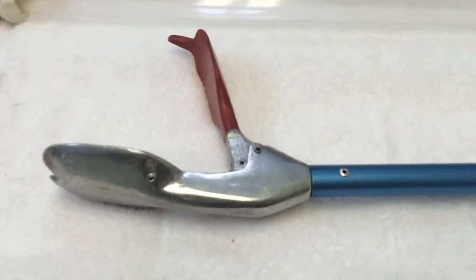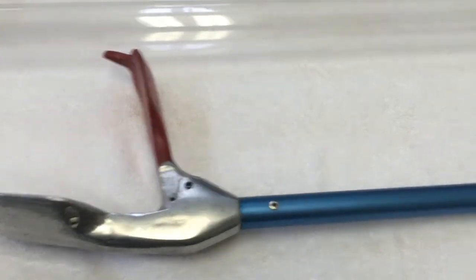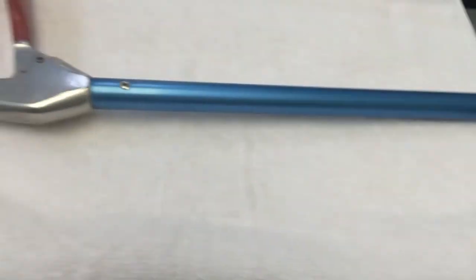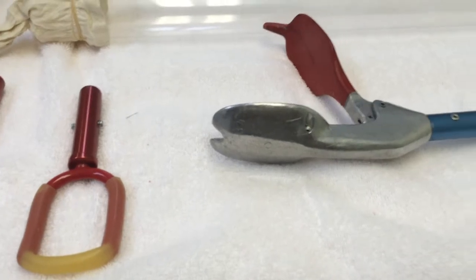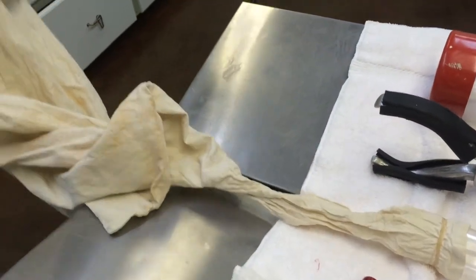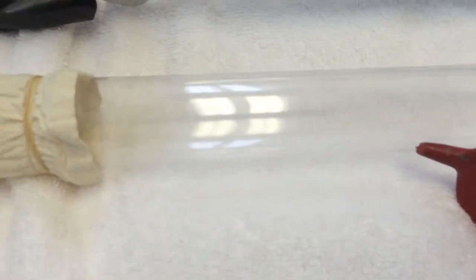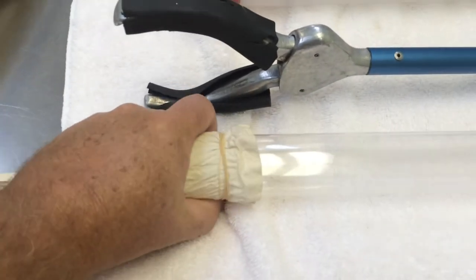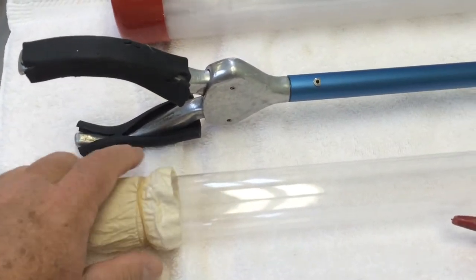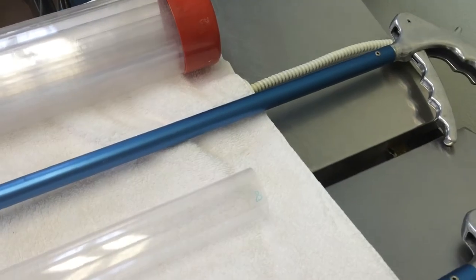Then we have here our gentle giants, the short version, because sometimes the long stuff just gets to be a pain in the butt. It turns out that my little bag here, you can actually put the snake in there. The snake will go in, be coursed into the tube. Once it's in the tube, I can grab it about right here and control it, pull the bag off, and then we can pump the gas in from this side over here, and we can anesthetize the snake.